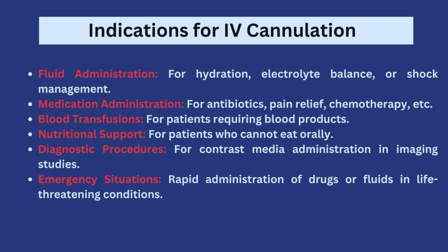It's also done if a patient cannot tolerate orally and the person needs to take nutrients, medication, fluids through the parenteral route. It can also be used for diagnostic procedures to insert contrast media for an imaging study such as your CT scans or your MRI scans. Then you also have emergency situations like when you want to administer drugs or you need to resuscitate a patient when they have lost a lot of fluid and blood and it has become a life threatening condition.